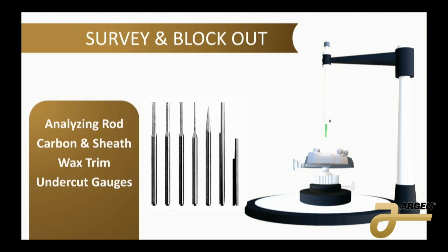Now the common mistake that I'm seeing in digital is you are still pouring a model, surveying it on your surveyor, drawing where you want your clasps, and then scanning it in. At that point, when you scan it in, how you survey it on your surveyor is never going to be how the software blocks it out. You can't actually align those two things. You have to block it out in the software.